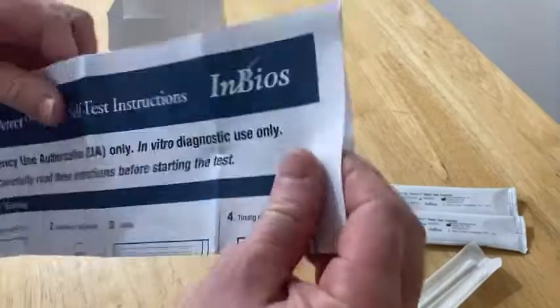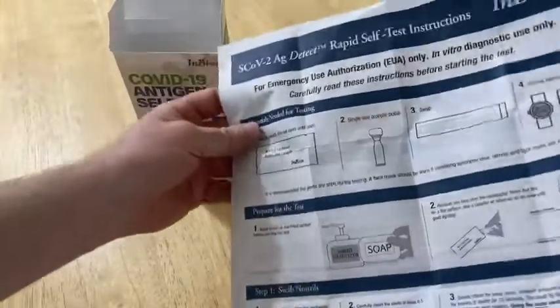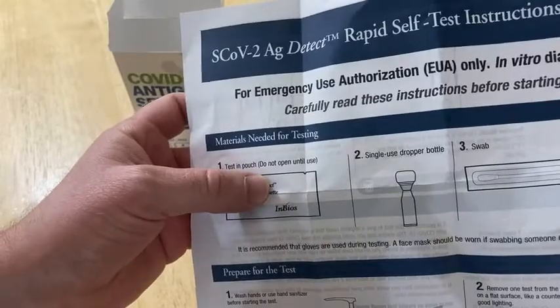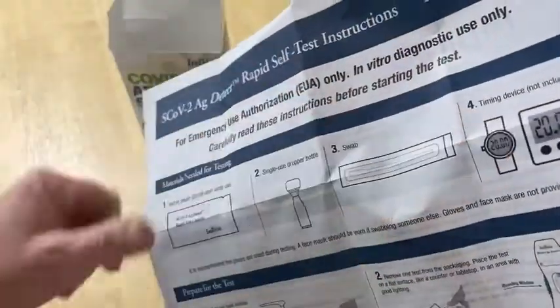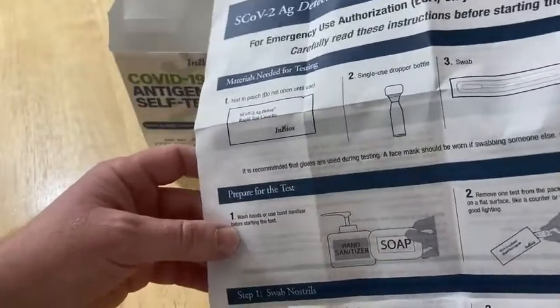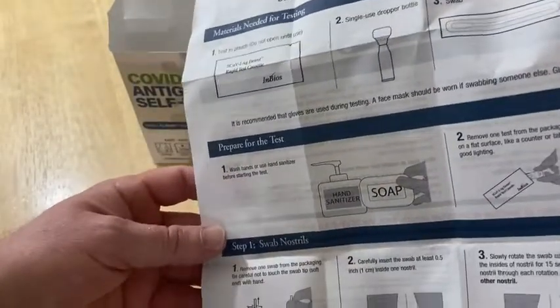Let's go ahead and look at the directions. The directions are really big, but they're also very clear. It says: test in pouch, do not open until use, single use dropper, swab, and a timing device which is not included. And you're supposed to wash your hands before you do the test.